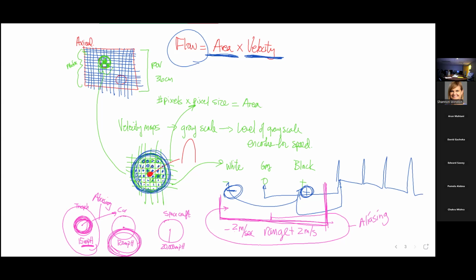Now, what happens if we put the space shuttle speedometer on the car? Well, it's set to go from 0 to 20,000 miles per hour. And so what happens there is, if this is 0, it's moved almost none. And so you don't capture the true velocity.